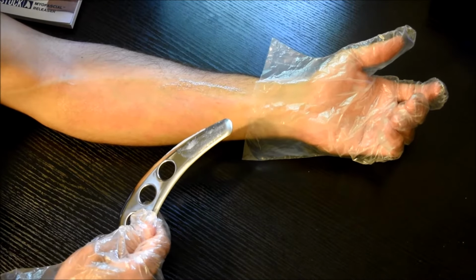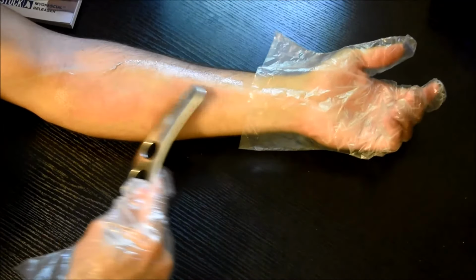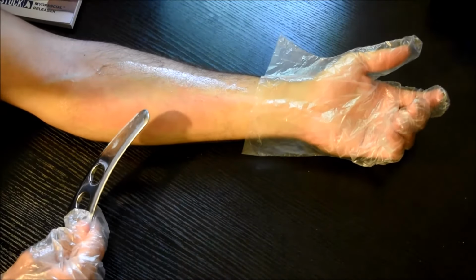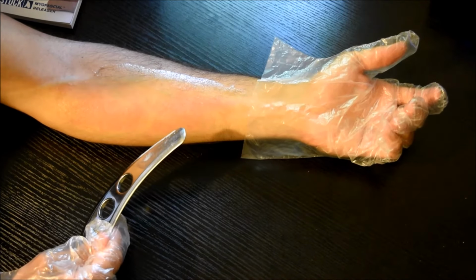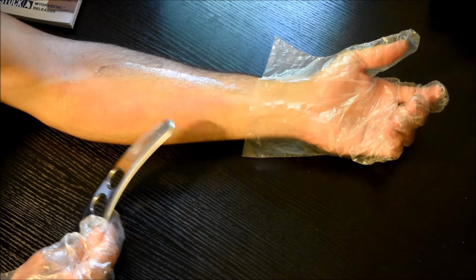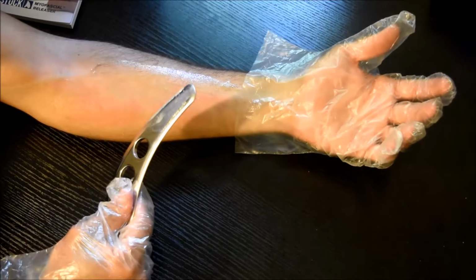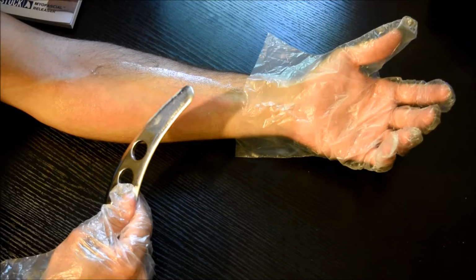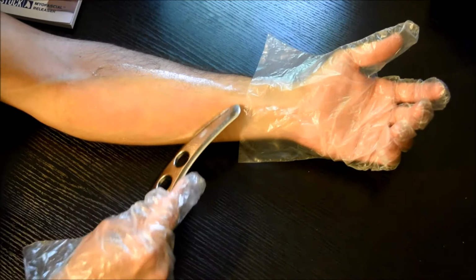Instrument assisted fascial mobilization. You would perform this about twice a week. You can do this 2 to 3 times a week, or if the patient is pretty much better and they're just trying to prevent a recurrence, then you can do this for preventative measures. You can do this once a week.